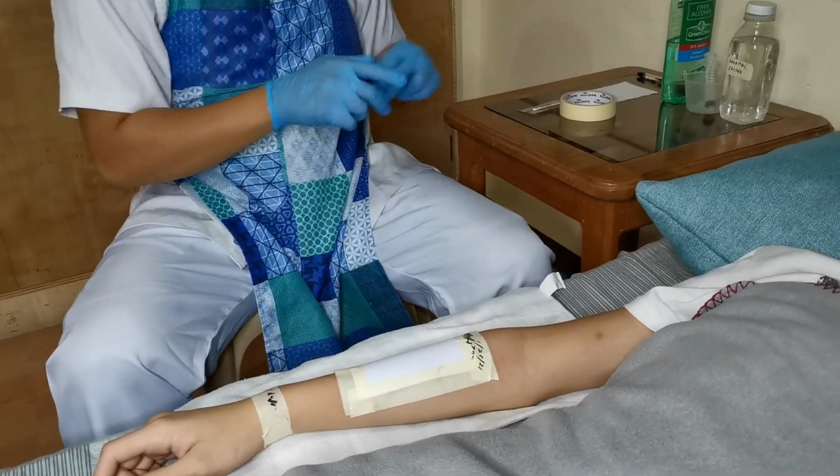Okay? Number 12. Remove your mask, gloves, and gown. This is done to prevent the spread of microorganisms.